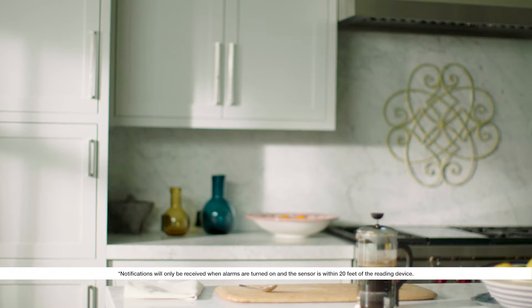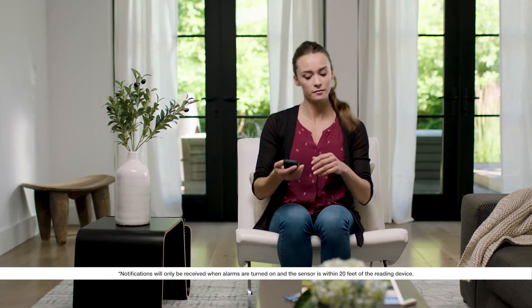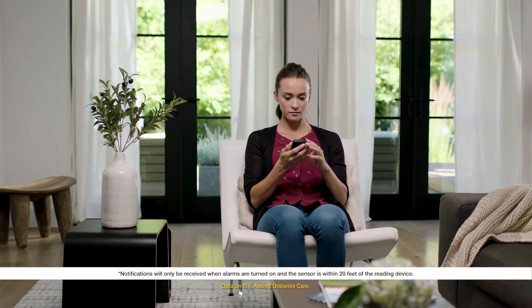Talk to your doctor about how to determine the high and low glucose levels you need to stay within your target glucose range. Setting up the alarms on your reader is easy — just follow these simple steps.